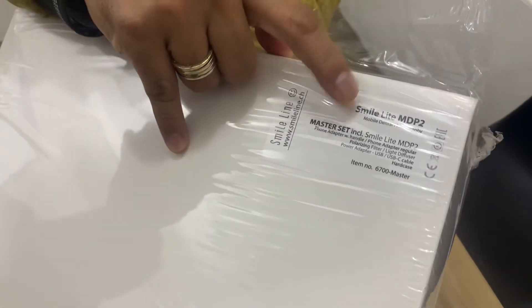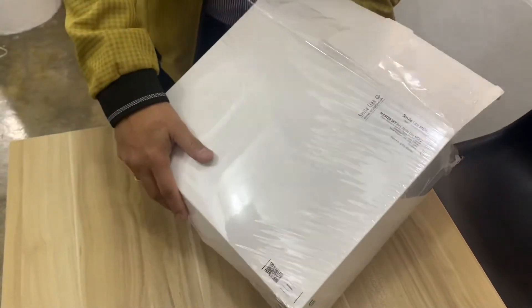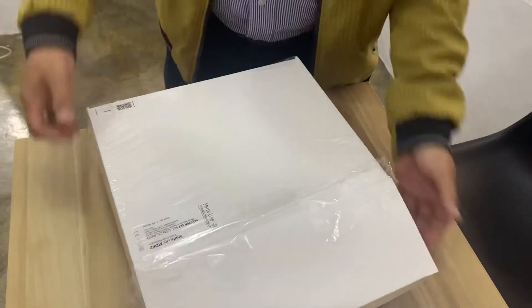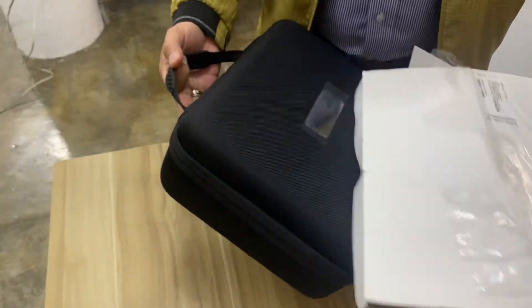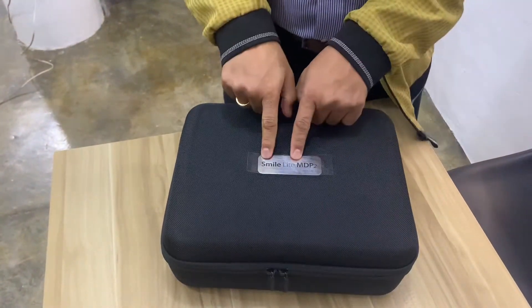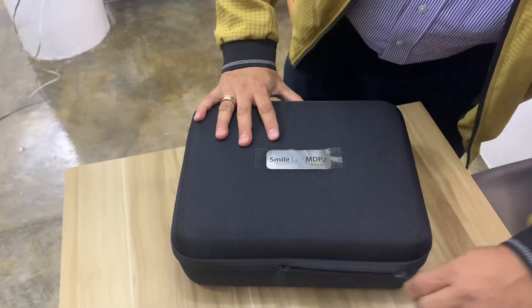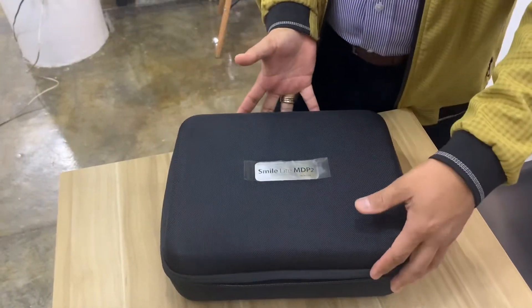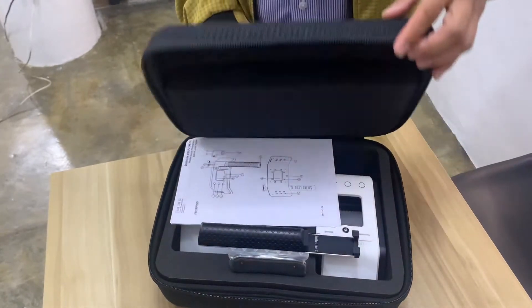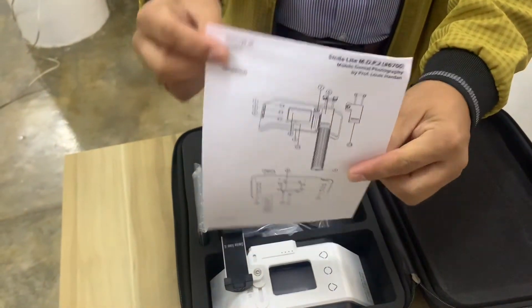This is the Smile Lite MDP2 from Smile Line in Switzerland — the latest in mobile dental photography. Let's unbox this. Inside this particular box it comes with all of this — wow, beautiful. This is the Smile Lite MDP2 by Smile Line, and inside this box it has this complete and beautiful mobile dental photography system.